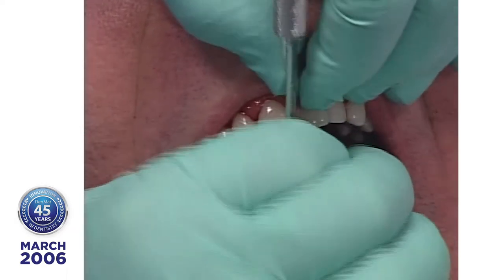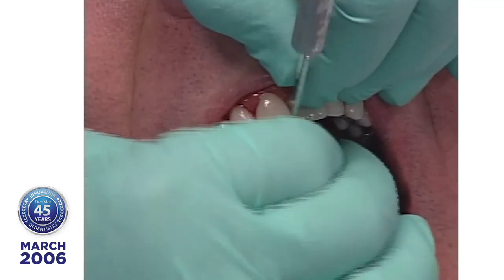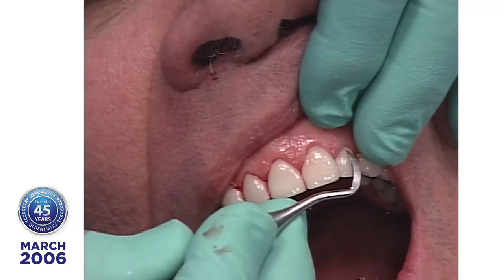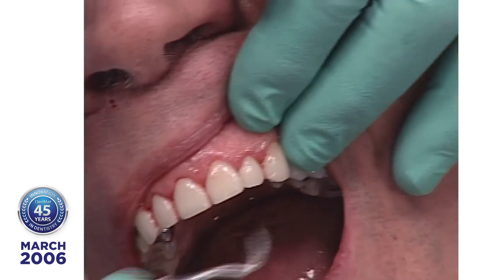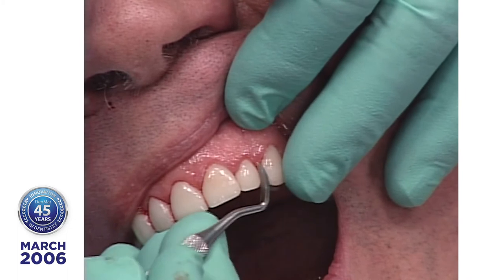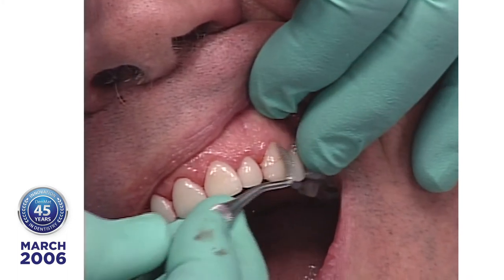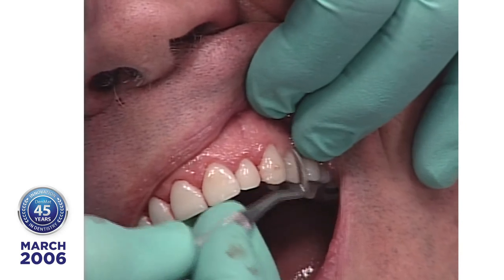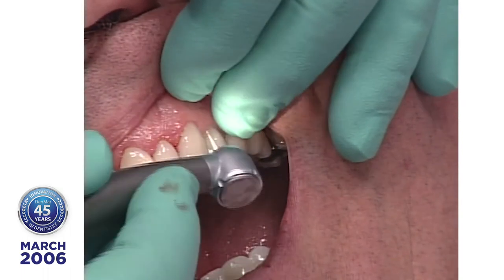And if you open, say, 2 out of 3, 3 out of 4, 1 out of 3, when the patients come back a week later, they've opened a lot of them themselves. And even the areas that were a little tight, so I'm using a lot of pressure, but finger control, rocking it, and I'm going to do a little bit more contouring so we have a good emergence profile.